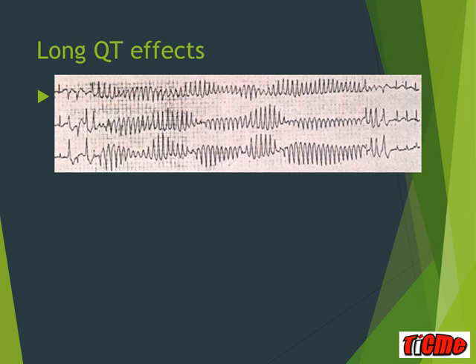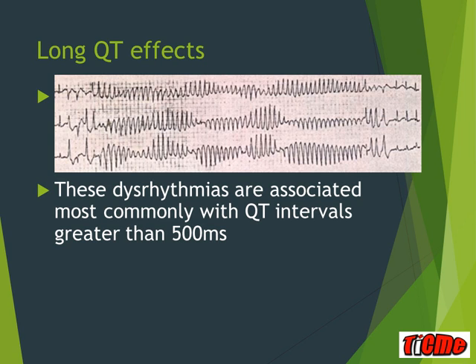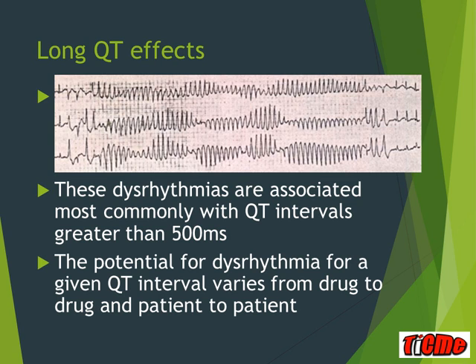Here's the classic ECG of someone with a long QT who flicks in and thankfully out of torsades. Generally, you don't get torsade unless the QT absolute is greater than 500 milliseconds. It is important to note, however, that your chance of having an arrhythmia for a given QT length varies significantly, depending on the drug taken and the patient.